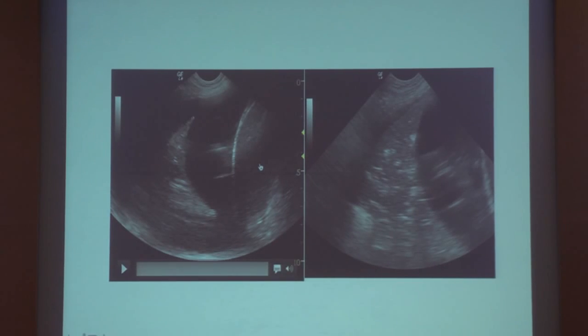In many of your patients, especially preeclampsia, they become fluid overloaded over time. Especially among some clinicians, there is a tendency to fluid fill them a little bit indiscreetly, I might say, which results over time in fluid overload, which typically gives rise to those B lines that I showed before. And it can also give you this kind of picture, which maybe some of you can guess.